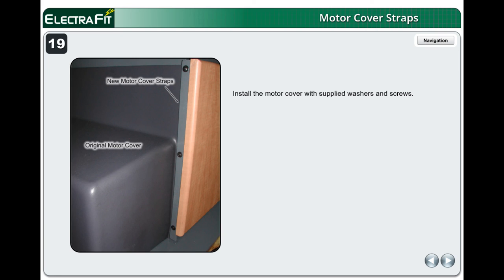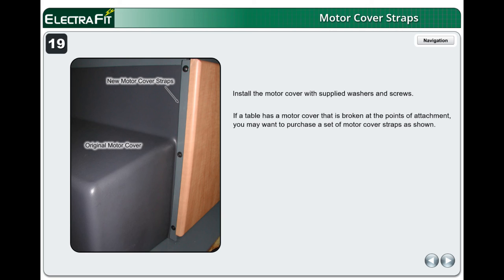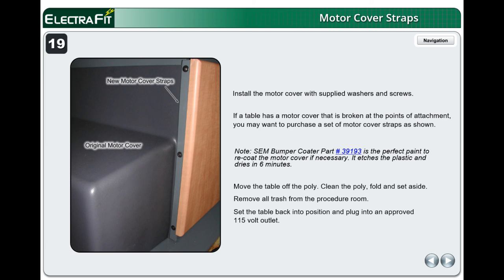Install the motor cover with supplied washers and screws. If a table has a motor cover that is broken at the points of attachment, you may want to purchase a set of motor cover straps. Note: SEM Bumper Coater Part Number 39193 is the perfect paint to recoat the motor cover if necessary — it etches the plastic and dries in 6 minutes. Move the table off the poly, clean, fold, and set aside. Remove all trash from the procedure room. Set the table back into position and plug into an approved 115-volt outlet. Perform leakage current tests.